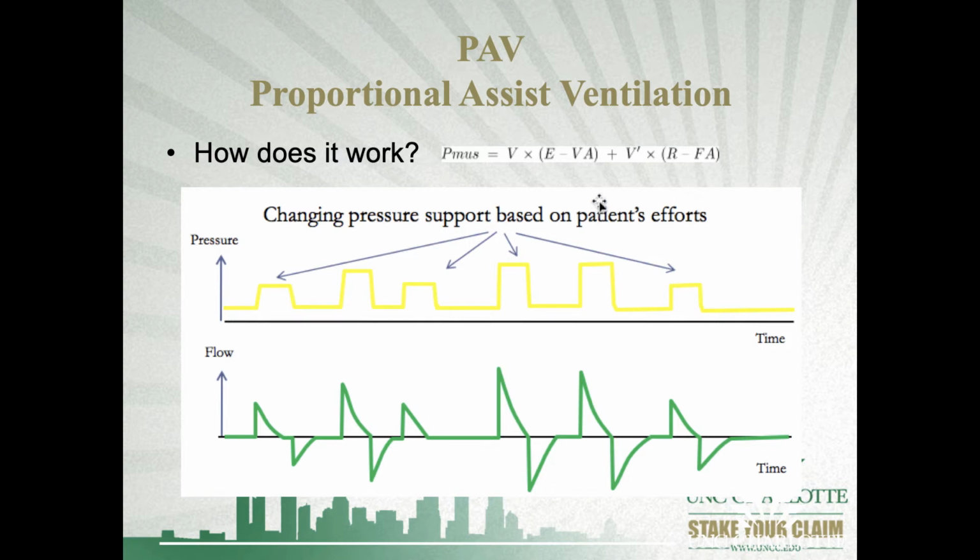Well, what the ventilator is doing is taking out, so this is volume assist and this is flow assist, the issues that are associated with each of these proportions. So our ventilator is going to subtract that assistance from our elastance in our lung, because that is a pressure we have to overcome when we take our tidal volumes, right? And of course, if we subtract flow assistance, which the ventilator would provide in this mode, we're augmenting or overcoming resistance that is imposed upon our patients via endotracheal tube, increased dead space in tubing, and so on and so forth.